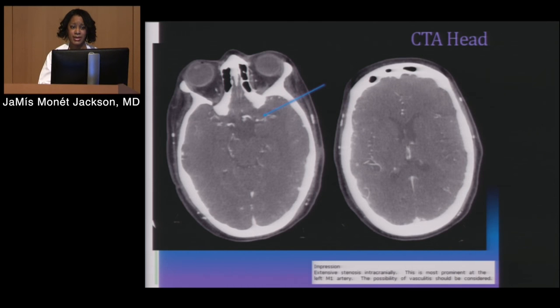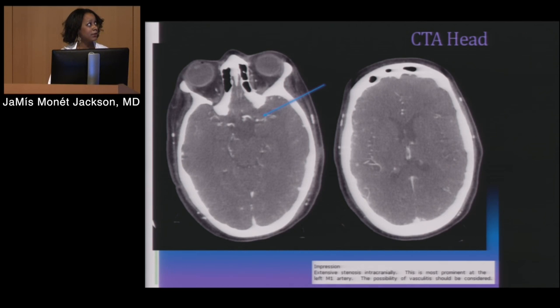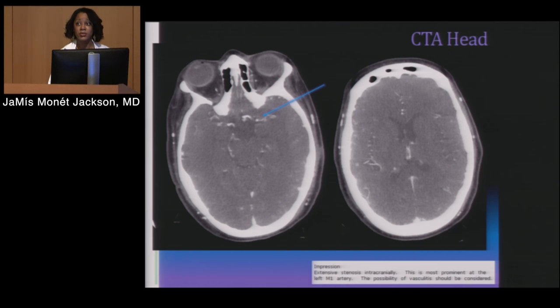This is her CTA. She did have a stroke, but the problem was she had already had multiple strokes because of very bad cerebrovascular disease. She had many areas of stenosis. This is looking at the left middle cerebral artery — the area most affected — which showed up as the stroke, as we'll see in a moment.